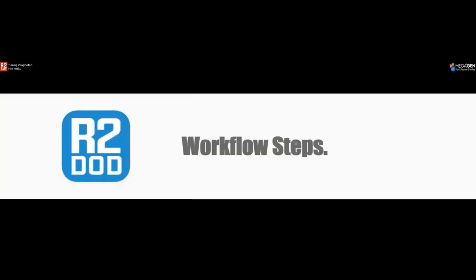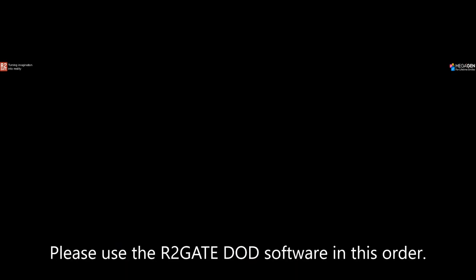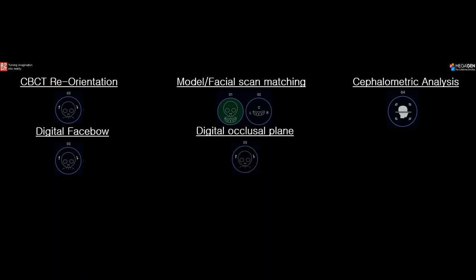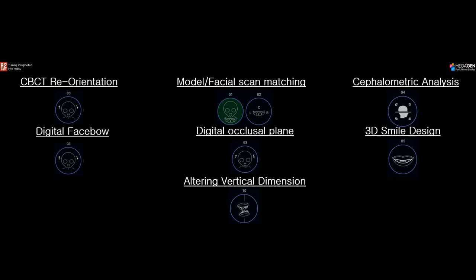In this video I'm going to explain the DOD Workflow Steps. First, we start with CBCT Reorientation — getting the CBCT scan and reorienting it to have a starting point for your treatment plan. Then we do the Model Facial Scan Matching in steps 1 and 2, Cephalometric Analysis in step 4, Digital Face Bow and Digital Occlusal Plane in step 3, 3D Smile Design, and then altering the vertical dimension if necessary.